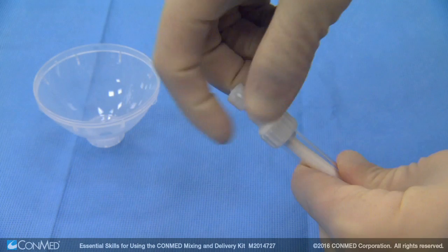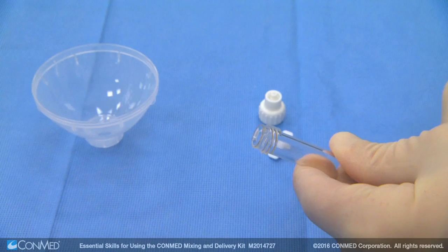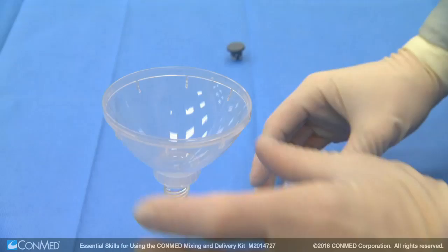To use the ConMed mixing and delivery kit, first remove the syringe cap and lure cap of the mixing syringe. Pull the plunger all the way back and securely attach the funnel to the end of the syringe.